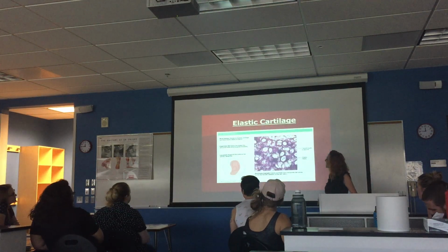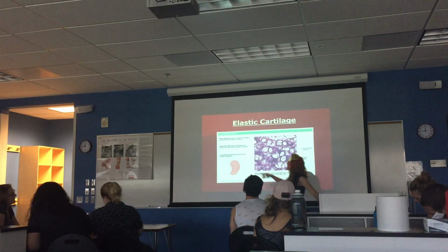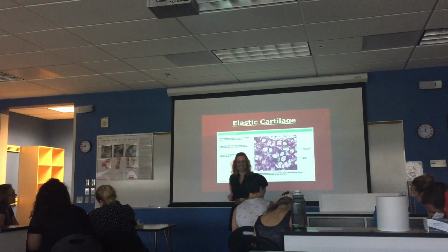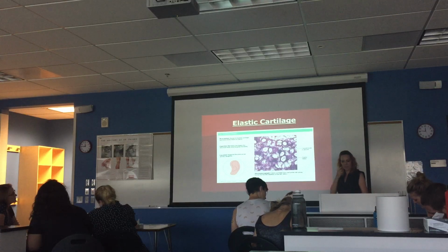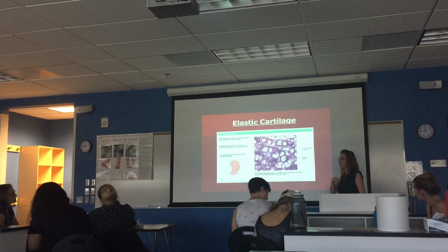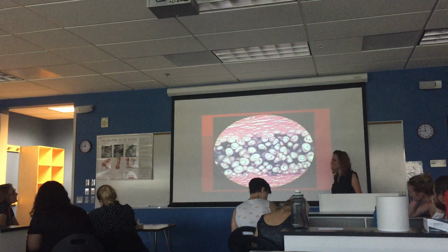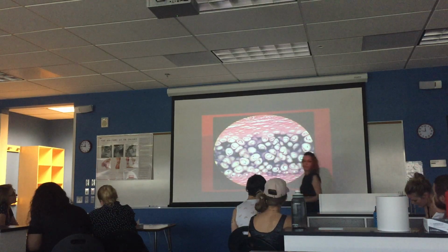All right, elastic cartilage. I love it when life is like this. Elastic cartilage is found in the external ear and epiglottis. Got it. That helps with memorization. It's like a mnemonic. So it's like hyaline, but it's bendier. Your ear is bendier than your nose. Try it. It's got more elastin fibers, so much so that you can actually see them in the extracellular area.